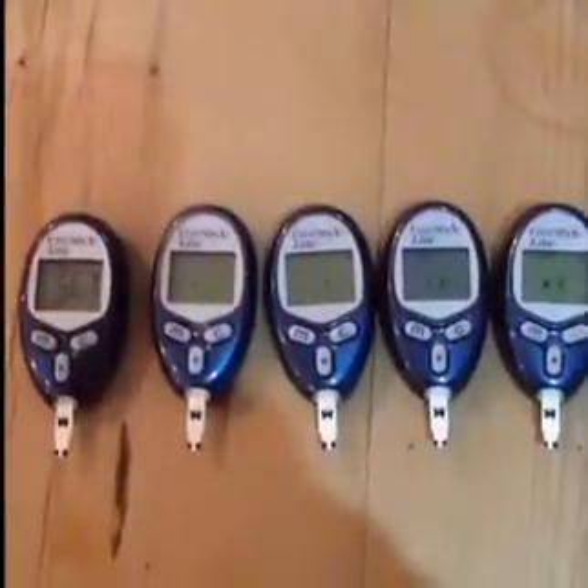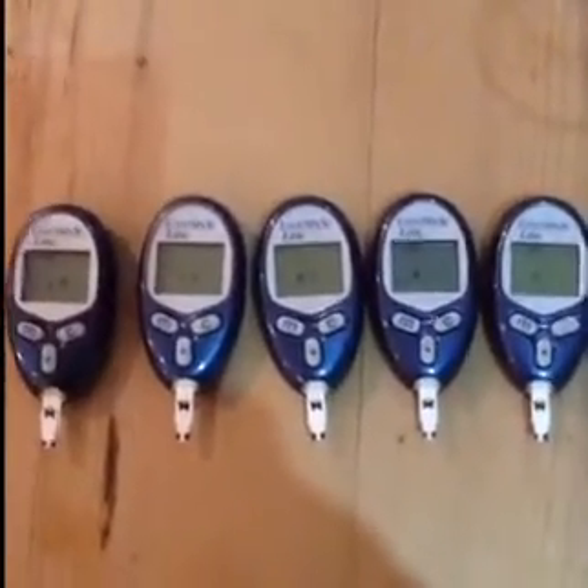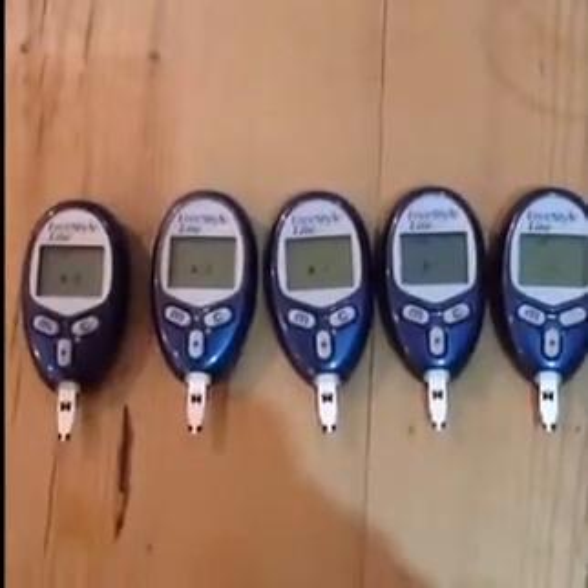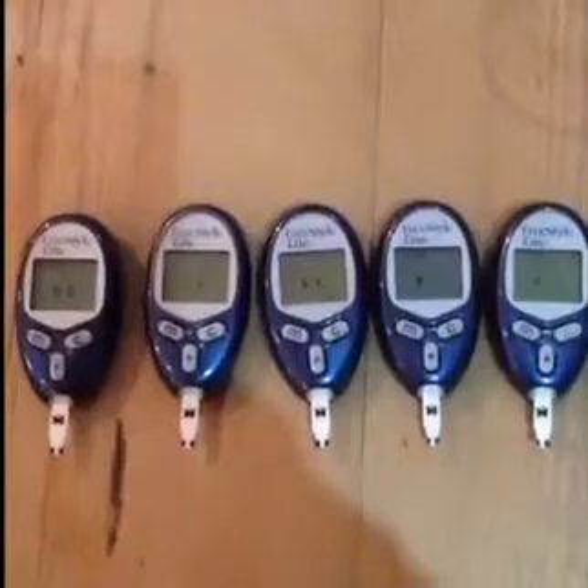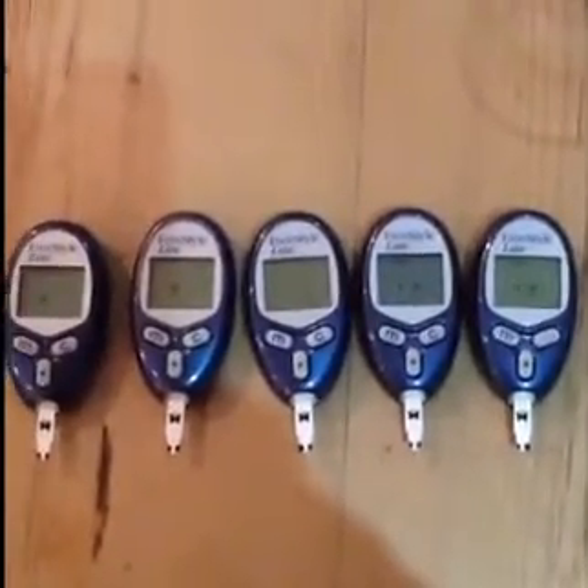I've taken five used test strips and literally torn them apart. You can do that with any test strip and it reveals the circuitry underneath. I've cleaned all these down with some water and dried them off with a hairdryer, not very intensely. Now I've put them back together again and inserted them all into the test meters. As you can see they're all eager to go.